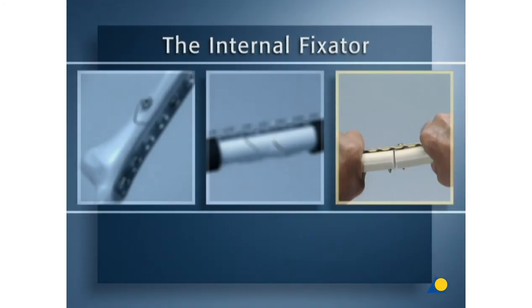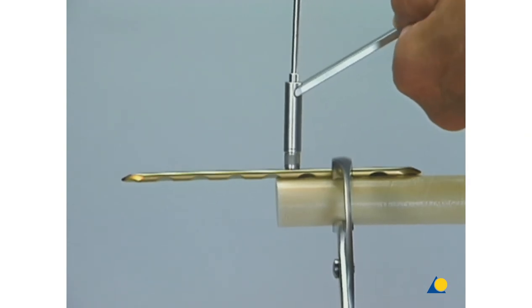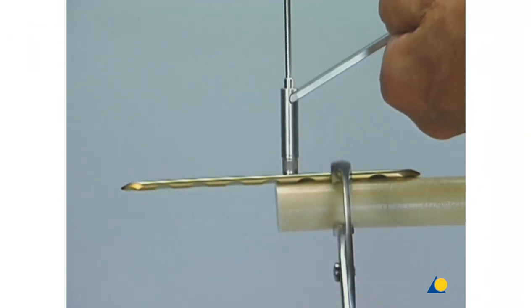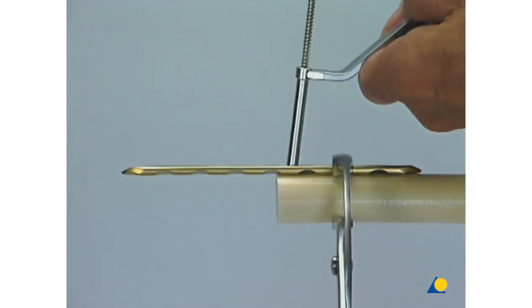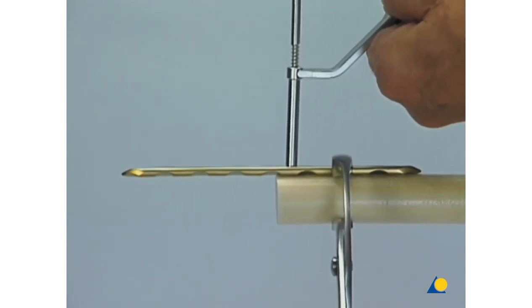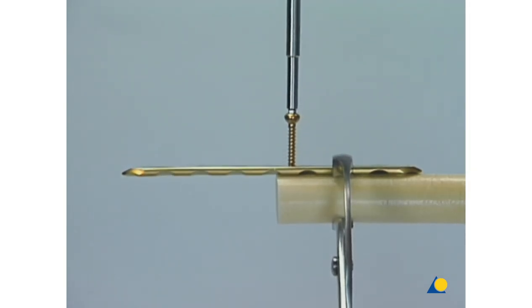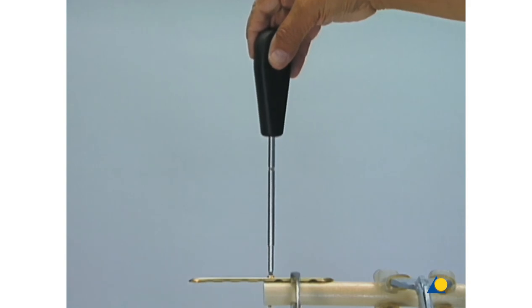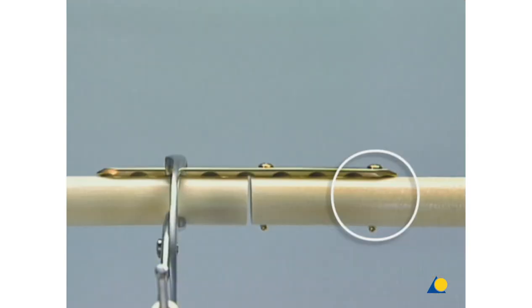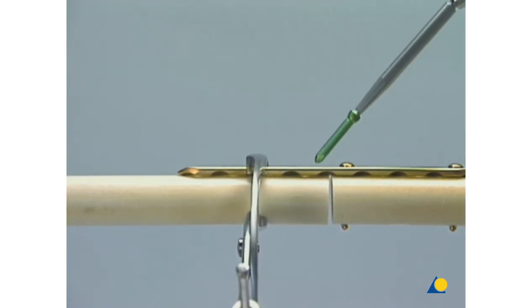The last exercise demonstrates the advantages of locking head screws in providing angular stability in osteoporotic bone. A generic model of softer bone quality is used, and a 4.5/5.0 8-hole LCP is fixed symmetrically onto the two fragments, leaving a gap of 2 to 3 millimeters between them. After pre-drilling and tapping, a standard 4.5 millimeter cortex screw is inserted. Care is taken not to strip the threads in the soft bone. A second cortex screw is placed in the last plate hole, and the opposite fragment is fixed with two locking head screws using the technique illustrated earlier.